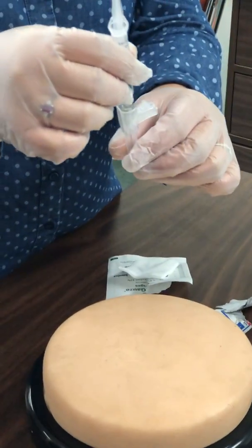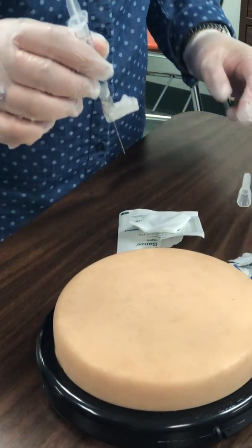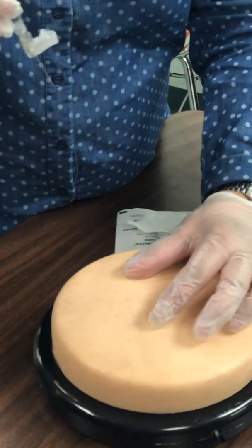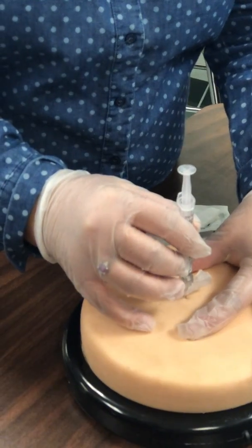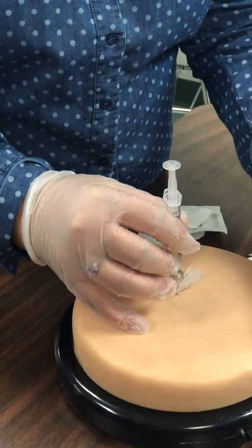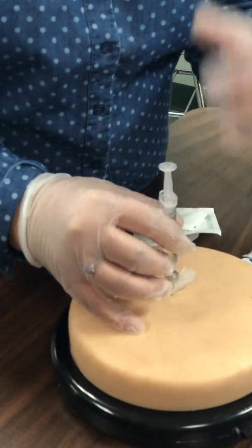There's only one way. It's 90 degrees. All right. So what do we do first? Not pinch. Spread the skin. Go in. All right. And then do not hesitate, because the patient is gonna get hurt more if you're too slow. All right. Do not hesitate. You just go in.